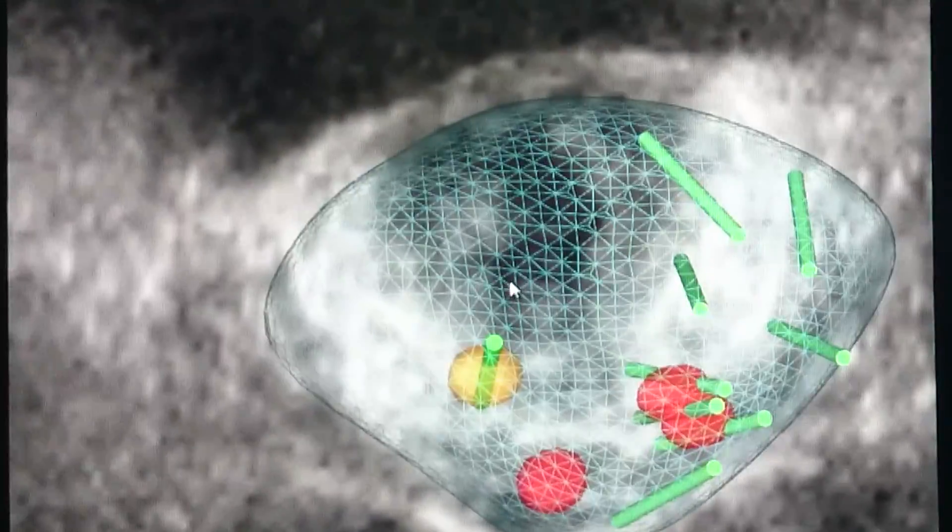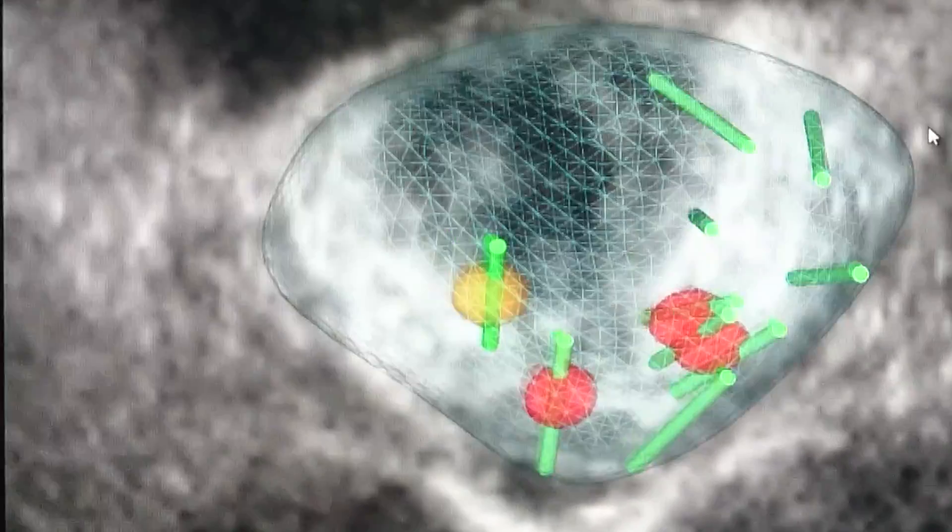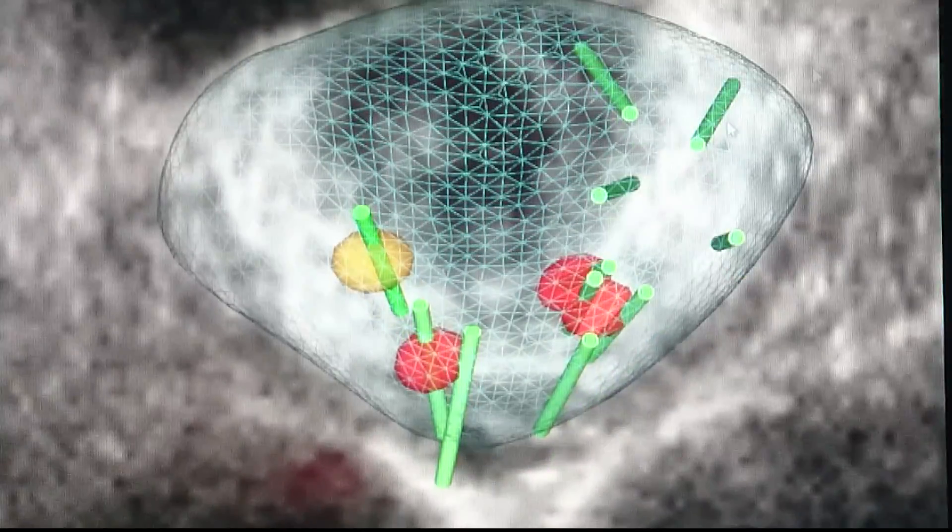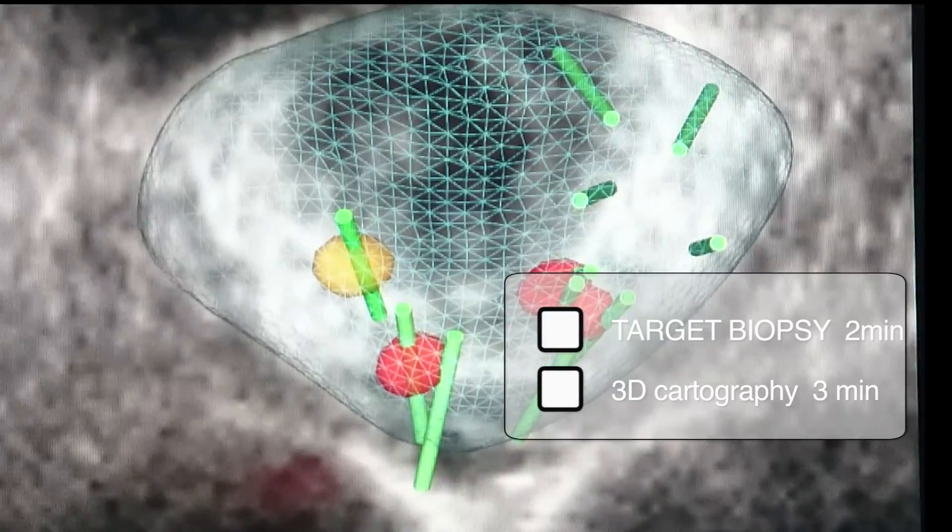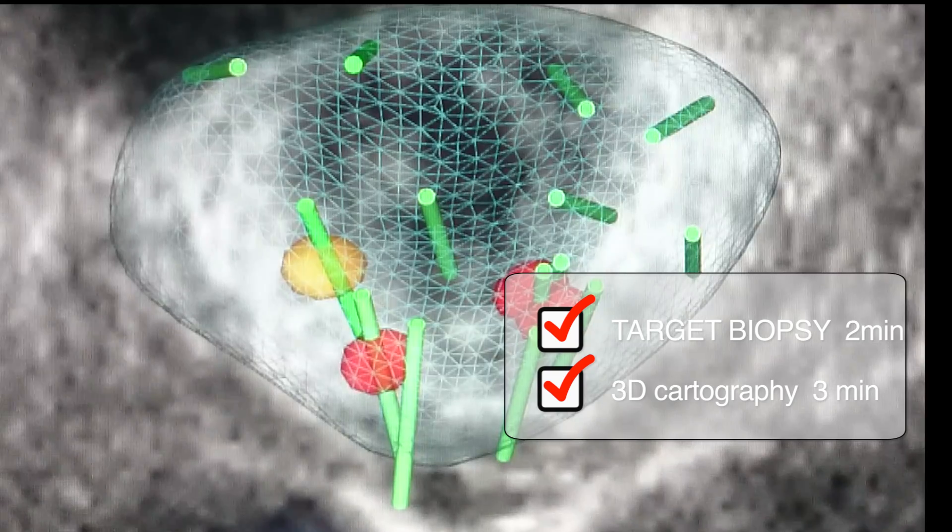Fusion cartography with controlled target biopsy improves the quality of biopsy series allowing visualization, guidance, and registration of each one. These biopsies will be reconsidered retrospectively and compared with histological data.